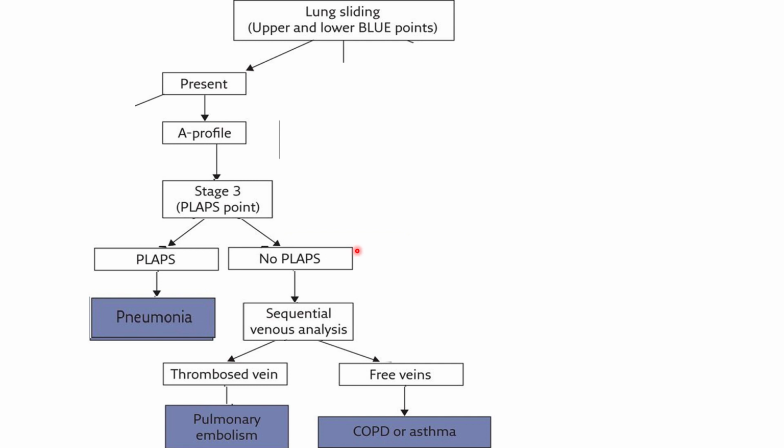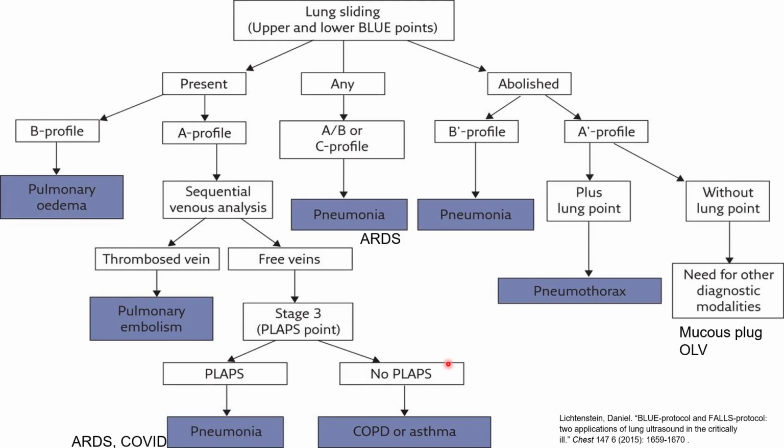Your last step is to evaluate the likelihood of pulmonary embolism. Look for DVT, as mentioned just before, and if positive, this is a pulmonary embolism until proven otherwise. If negative, this is some larger airway disease such as asthma or COPD. That's it. The entire protocol all put together looks daunting, but if you break it down, it's really not so bad.